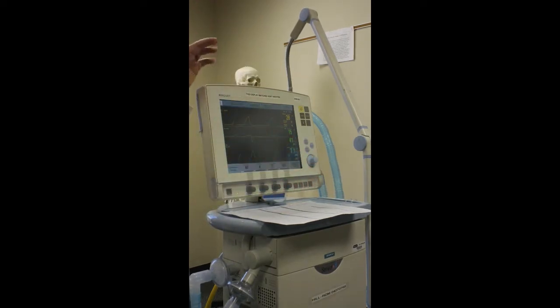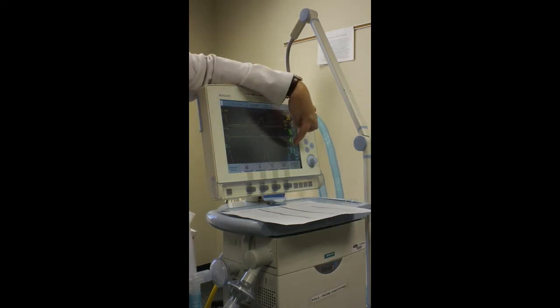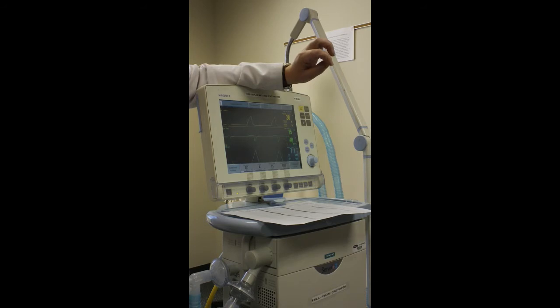Because remember, we don't actually set a number. We don't dial in a number that says, I want a minute ventilation of 6.0. We set our minute ventilation by setting our rate and our tidal volume. So once we set them, we can see if our minute ventilation is about where we want it to be. As long as it's less than 10 and over 5, you're usually okay. Patients that are very tachypneic will have a higher one, of course.